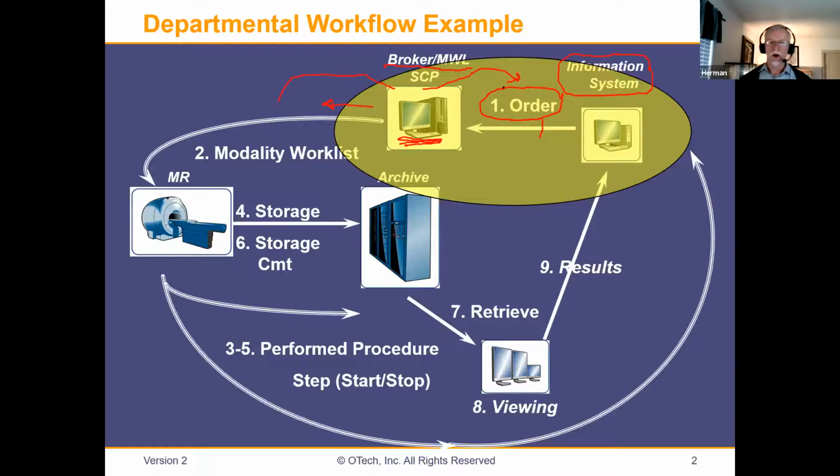The thing I'm not going to talk about is the mapping of the HL7 results back into DICOM, because that is relatively straightforward. If you have a result, a diagnostic report for example, in many cases there will be an HL7 ORU message. ORU means result. And then we would potentially map that back into a DICOM structured report or some other form. And that's relatively straightforward.